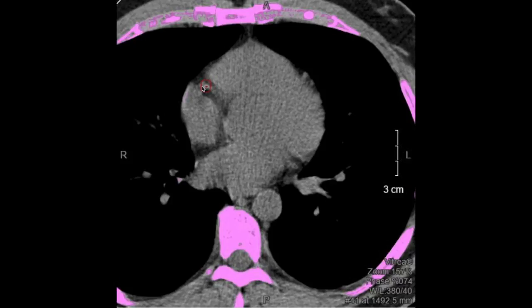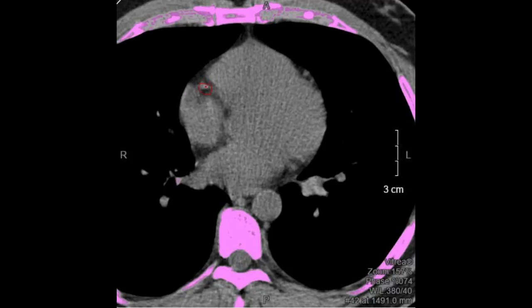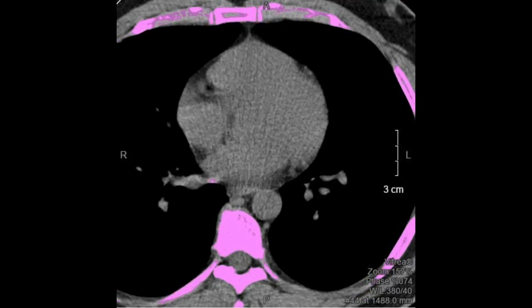I scored a 1. So what happens is you total up all of your calcifications, and that's basically your score. So with me, I got a 15. This is a 1. The left anterior descending, I got a 4, and then the left circumflex, I got a 10. So in total, I got a 15. Hopefully when you get yours done, yours is maybe even lower than mine.